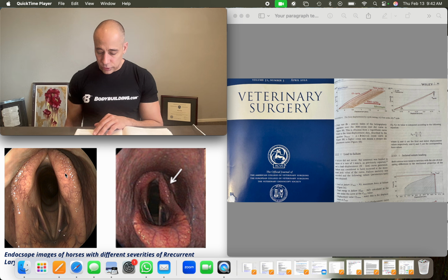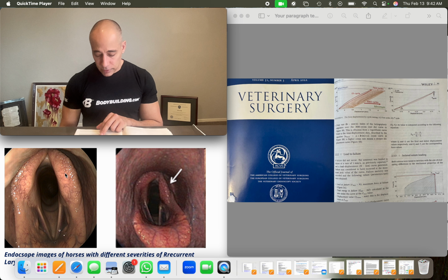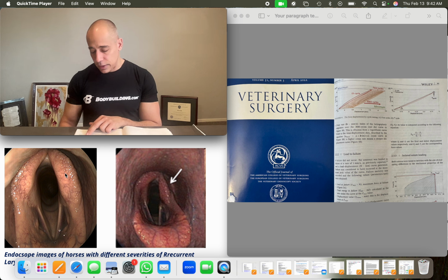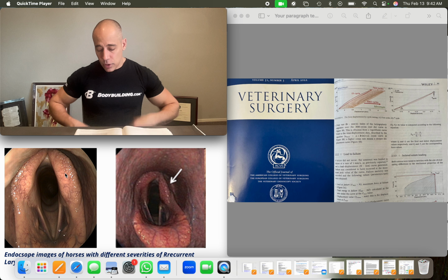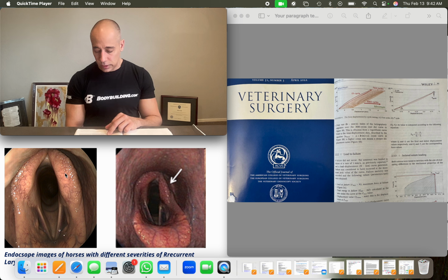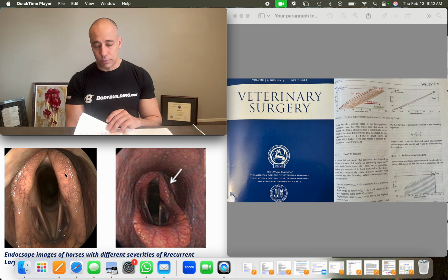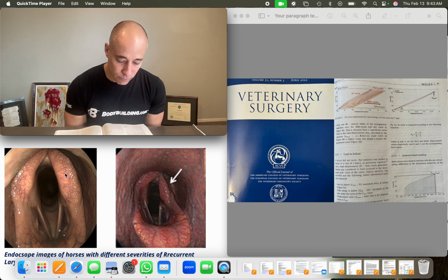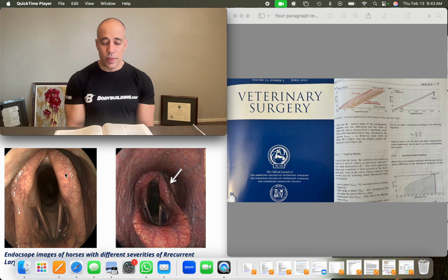The cannula with tiger tape constructs failed at higher loads, 129.51 newtons, versus the Ethibond group at 93.16 newtons, and the Ethibond cannula group at 81.72 newtons, whereas the Ethibond and Ethibond cannula constructs were less stiff than the tiger tape and tiger tape with cannula. So the conclusion was biomechanical properties were generally superior for the tiger tape cannula constructs under cyclic loading. The cannula in both the Ethibond and tiger tape reduced the failure at the muscular process. The clinical significance is that these results provide evidence to support the in vivo evaluation of the polyblend tape suture with or without a cannula in the muscular process of laryngoplasty in horses.